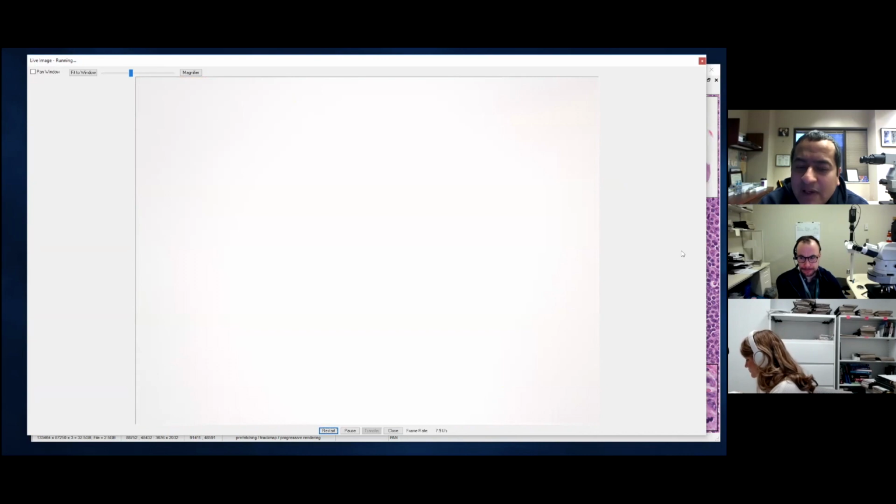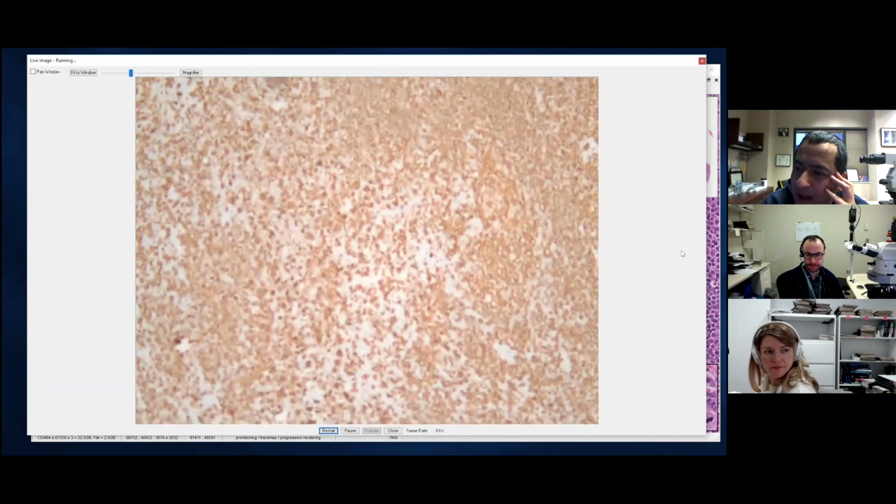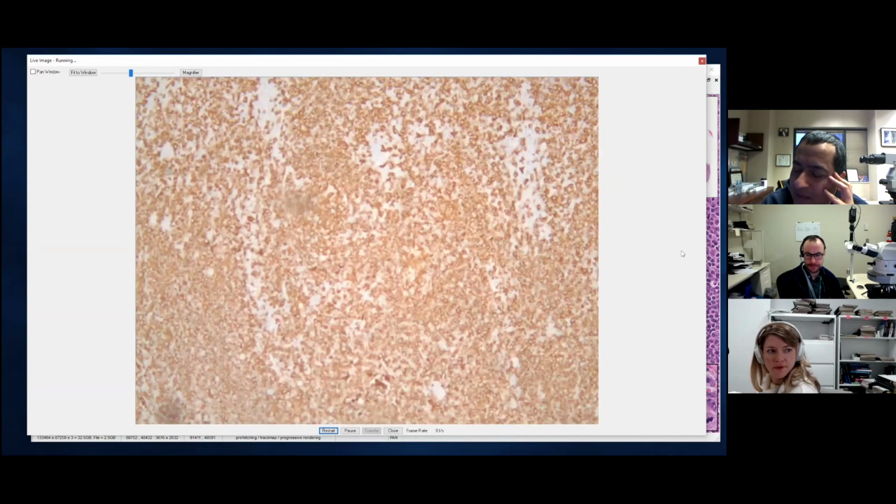Now, is it possible, Eve, that some of the process is a reactive hyperplasia and the MALT is only part of the mass, or does it always completely replace the underlying tissue? Yeah, I think it's probably like follicular lymphoma, where we now have a well-defined entity, in situ follicular neoplasia, because we can see that bright BCL2 within the germinal center, and it's just these two follicles here.